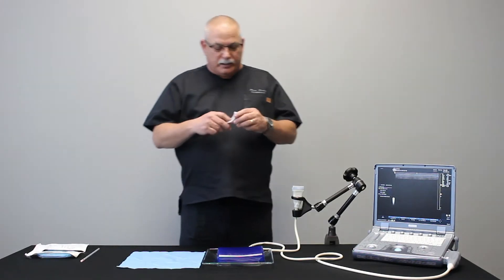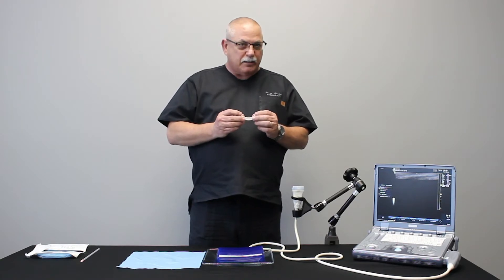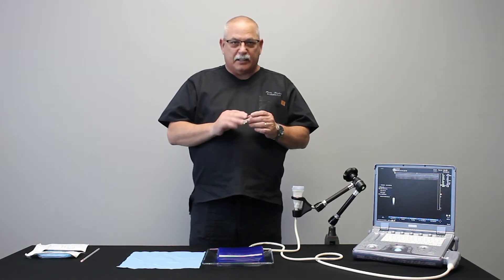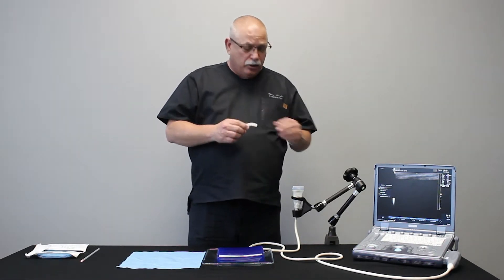First, I want to attach the bracket. It's important to understand the bracket is customized to every transducer and the bracket is reusable — it is not disposable. So at the end of the procedure you want to be sure and keep your bracket.